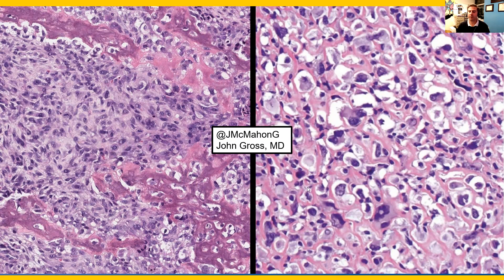On the right, we have an anaplastic sarcoma, which again is directly producing this mineralized osteoid matrix, which is our definition for an osteosarcoma. You'll see there's no osteoblastic rimming in this tissue.